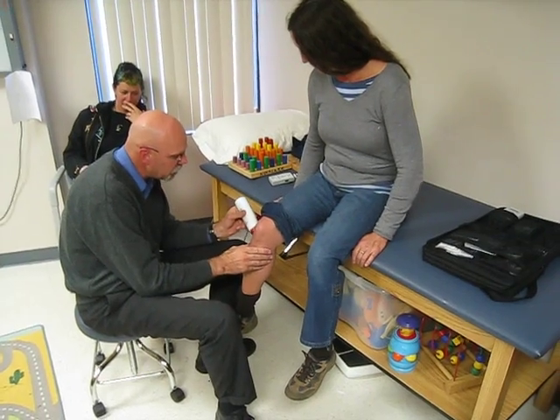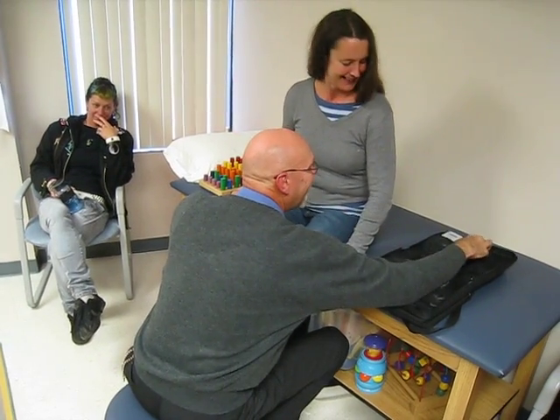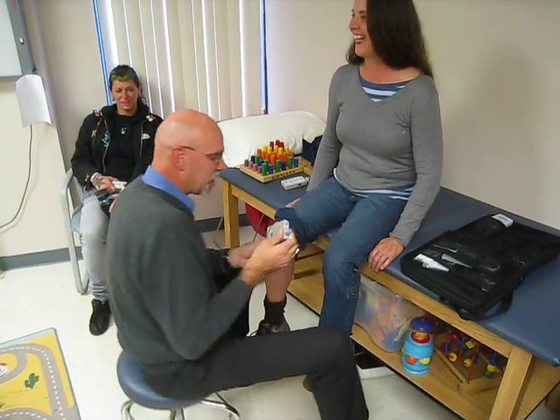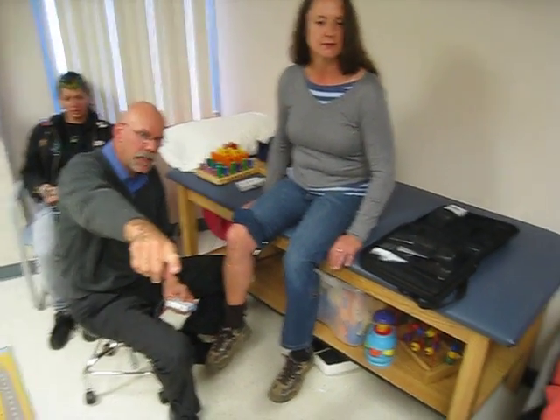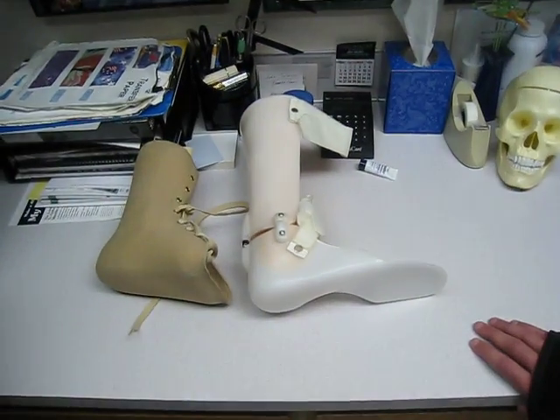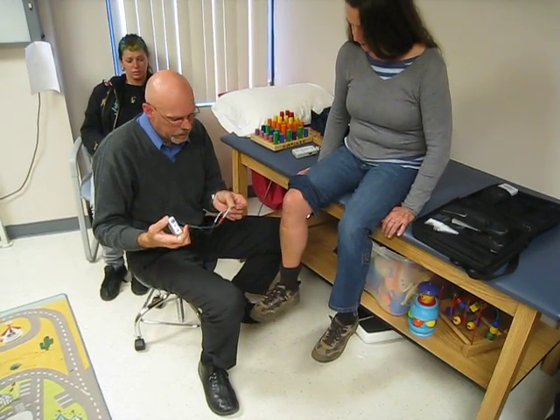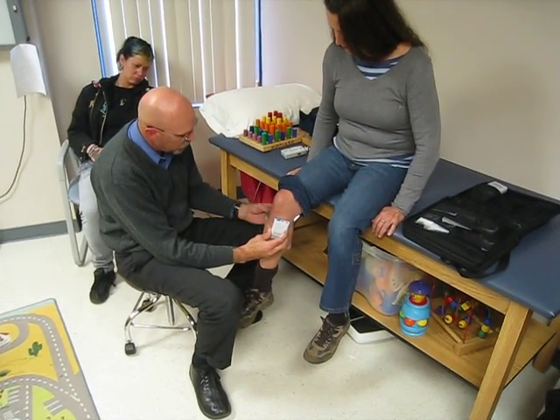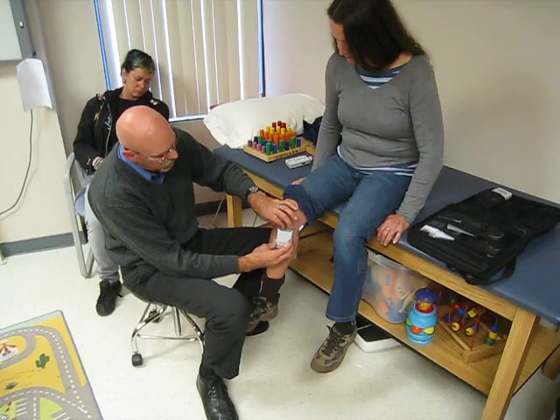This just gives it a little bit better conductivity. So basically, this is the unit. You can see that plastic brace — that's typically what people wear to hold their foot up and keep it from dropping, to prevent toe drag. Now they have this unit, and all you would wear is this, with these two electrodes sitting over where they need to be, and that would keep the foot up. You turn this on like that.